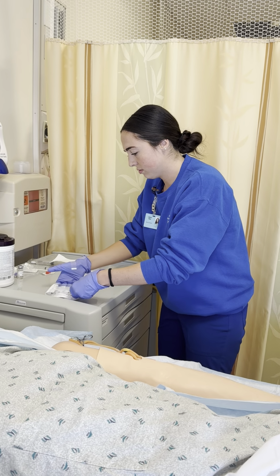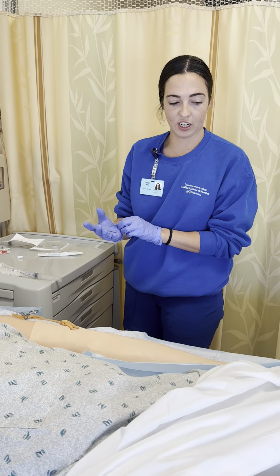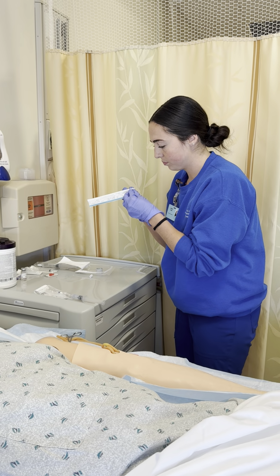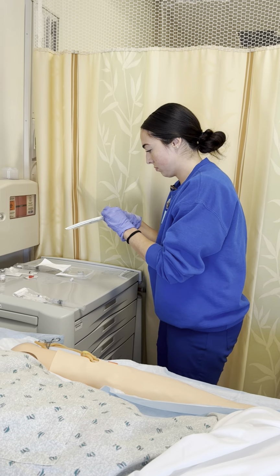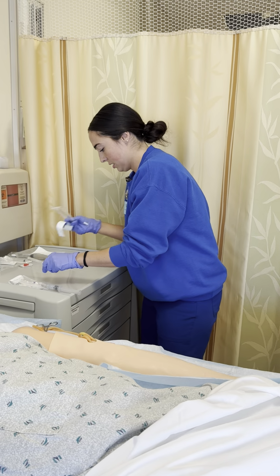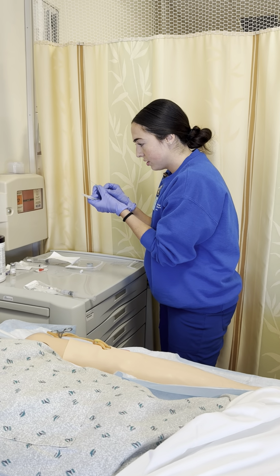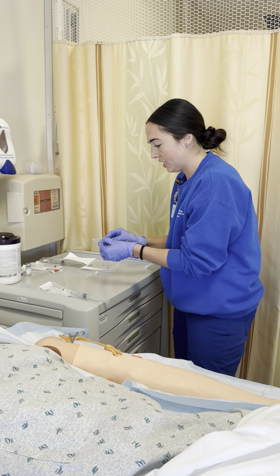Everything over. Make sure it's within reach, so that whenever I'm doing my IV, I've got it here next to me. So we're going to open up our IV catheter. And I'm going to make sure that our IV cap comes off. Looks great. Make sure that the bevel is up. And I'm going to scoop it into here.